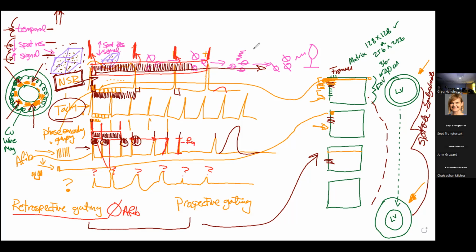There are a lot of ways that these gating algorithms work, but there are times when the QRS signal we just don't appreciate very well, or we have a lot of PVCs, or sometimes we get a QRS like this, and then another one like this, and there's massive confusion. So there's no trigger. Whether we're trying to do prospective or retrospective, nobody can find what the heck's going on.